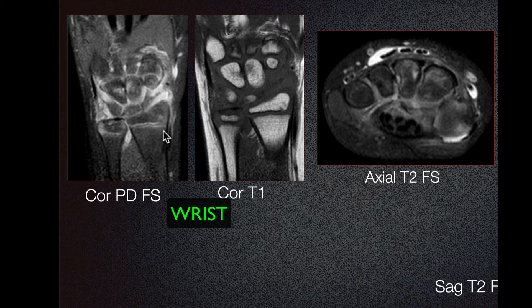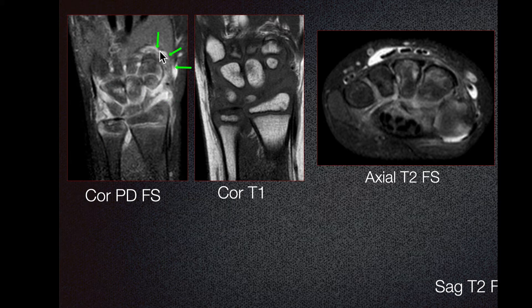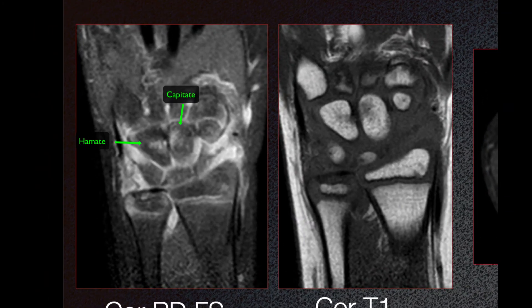Here on the left-hand side, we can see coronal proton density fluid-sensitive images. We can see joint effusion in the distal radio-ulnar joint, the radiocarpal joint, and the intercarpal articulations. There is also synovial thickening, as seen here. These findings are consistent with underlying synovitis. We also note bone marrow edema involving the capitate and the hamate, which are signs of active inflammation.